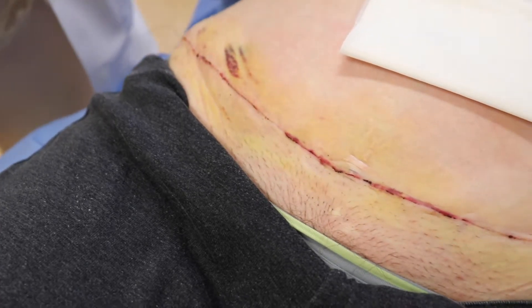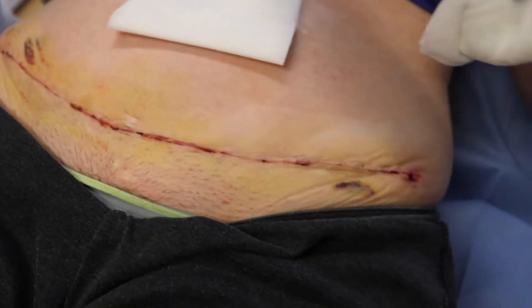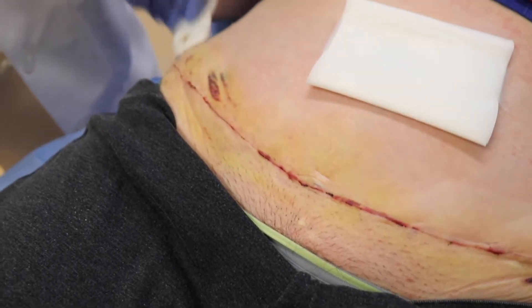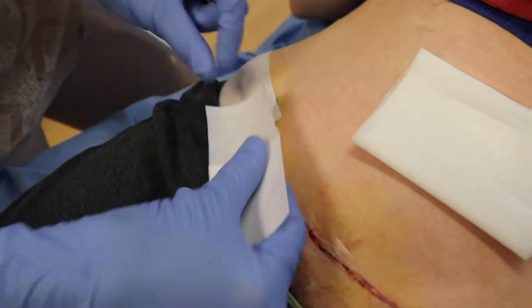After the tape is removed, there may be a small amount of bleeding, which is normal. You can gently blot this away with a clean gauze. You can also use a little bit of salt water or wound spray to cleanse the wound. Allow it to dry and then replace the tape in the same direction that it was placed previously.